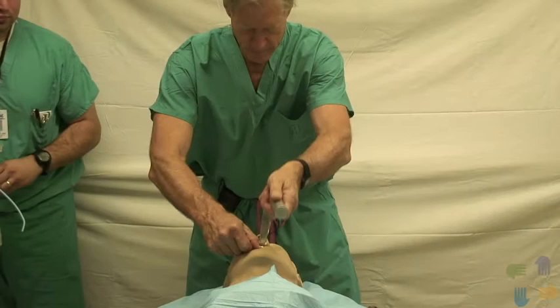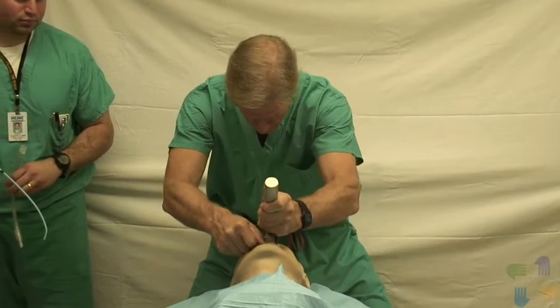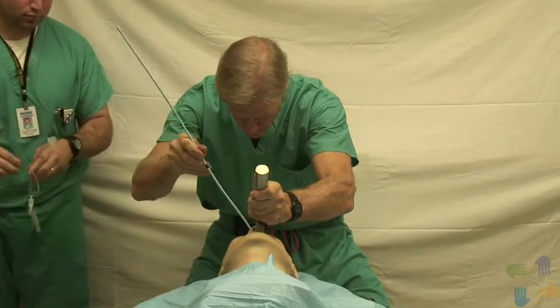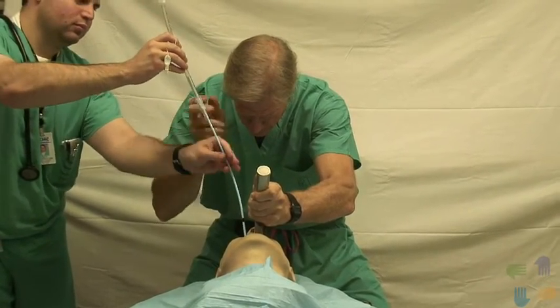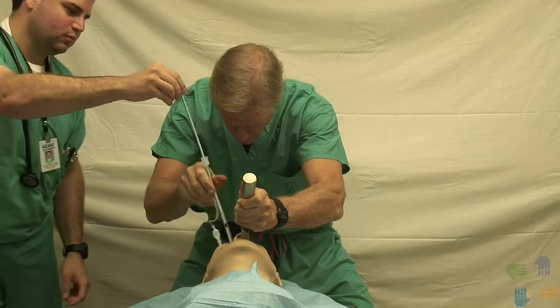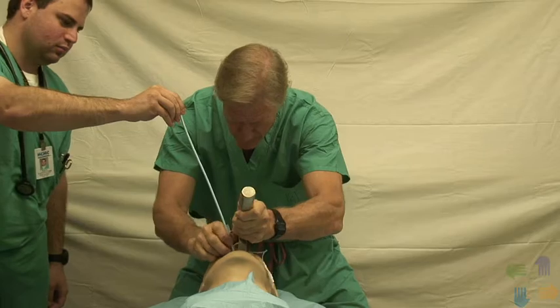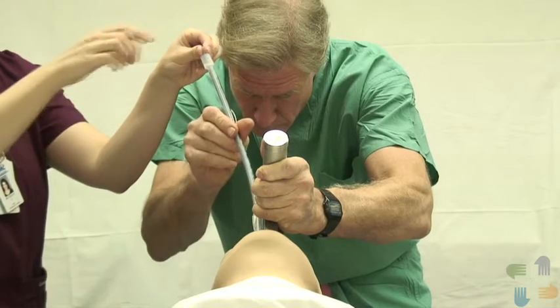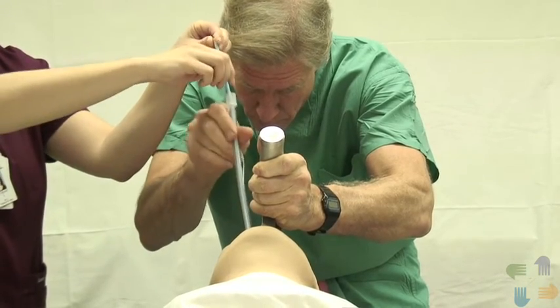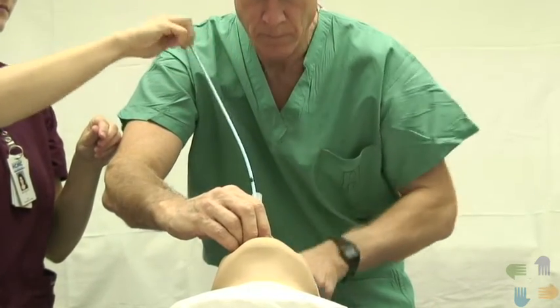Bougie-assisted orotracheal intubation is ideally a 2-person procedure. After the operator obtains maximum laryngoscopic visualization, he or she is handed the bougie by the assistant and advances it into the airway. With the laryngoscope still in place, the assistant threads the endotracheal tube over the bougie, and the operator advances it through the larynx and into the trachea. At this point, the bougie is removed and the endotracheal tube position is verified. A counterclockwise rotation of the endotracheal tube as it approaches the larynx is advised because it will decrease the chance of the tube catching on the laryngeal soft tissue.